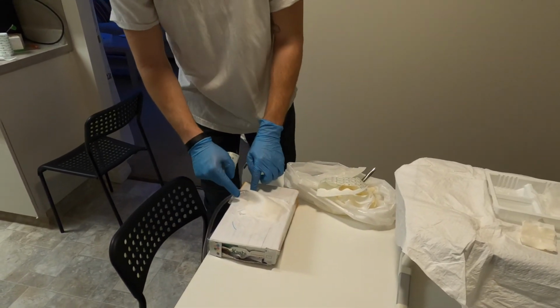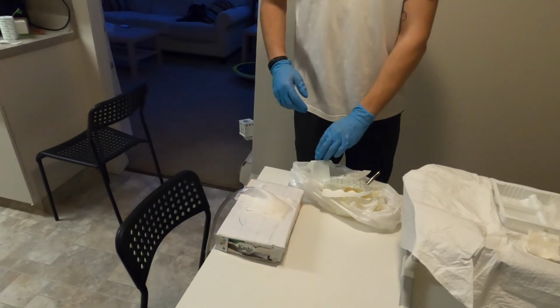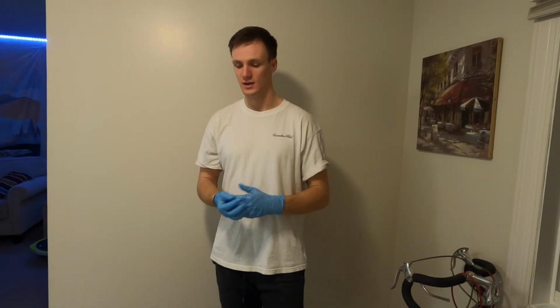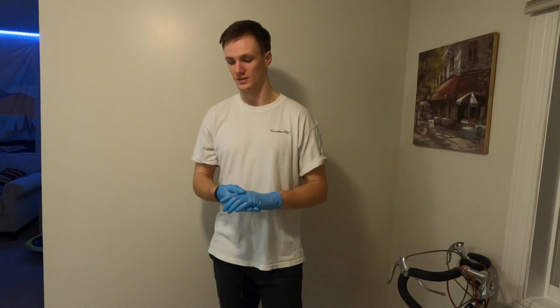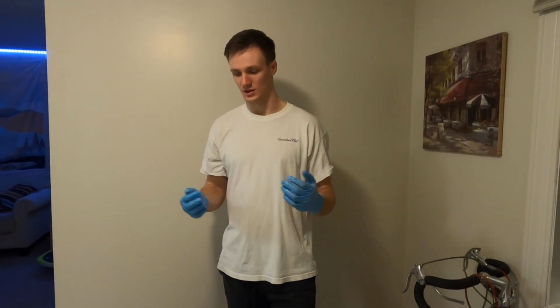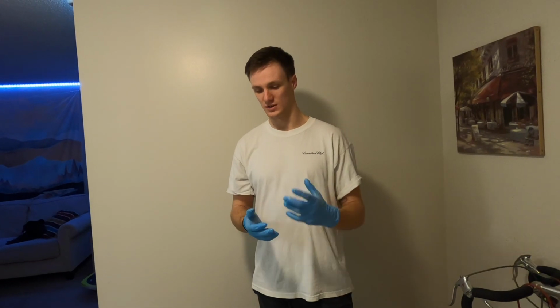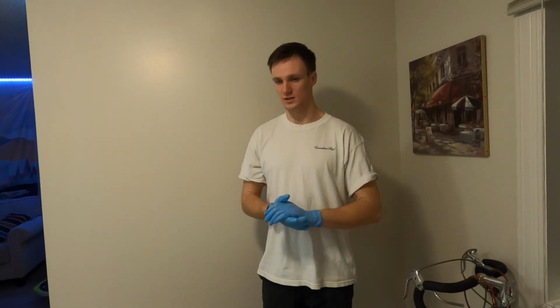So I see that the date there is kind of unreadable, so I'm going to sign, or I would sign the Fixomull again. So now the dressing's done. What I'm going to do is collect my supplies, do a safety check as I leave. I'm going to make sure to document the peri-wound condition, that the chest tube was well approximated and in the correct position, or in the position it was when it was inserted, how the patient tolerated the procedure, and what was used to clean the peri-wound, what the old dressing consisted of, if there was any drainage, what the new dressing consisted of, and yeah, so that's that. So I do a safety check as I leave and head out.